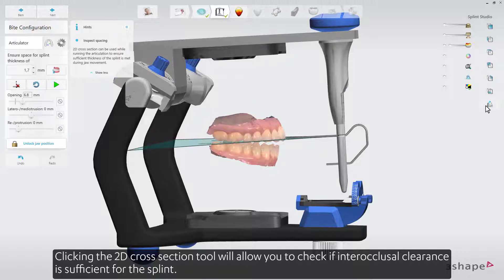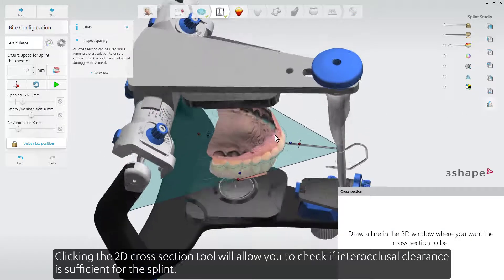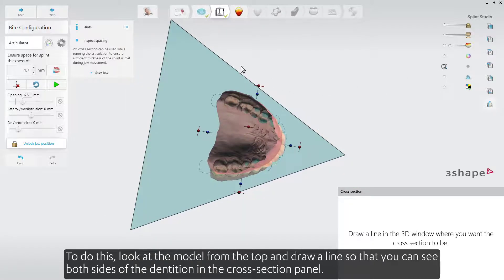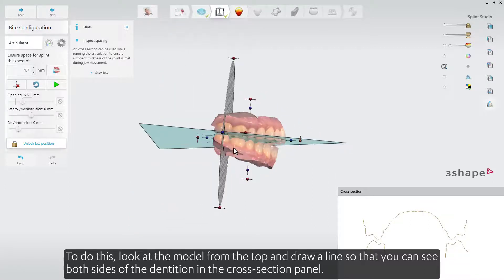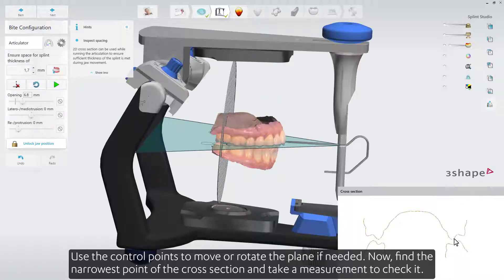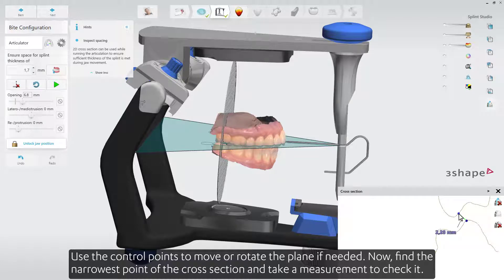Clicking the 2D cross-section tool will allow you to check if interocclusal clearance is sufficient for the splint. To do this, look at the model from the top and draw a line so that you can see both sides of the dentition in the cross-section panel. Use the control points to move or rotate the plane if needed. Then find the narrowest point of the cross-section and take a measurement to check it.